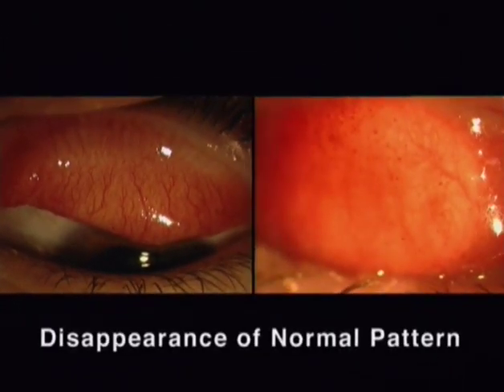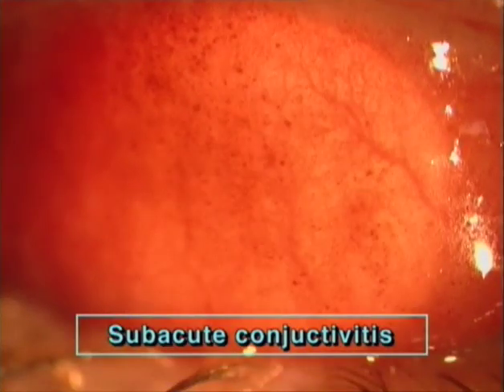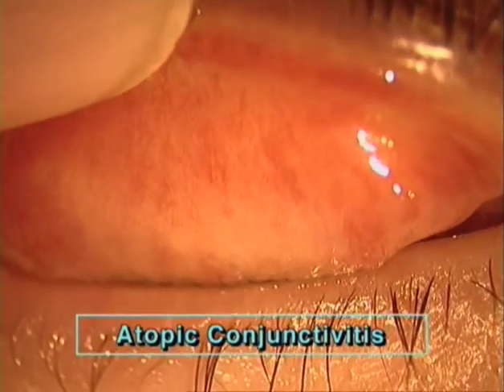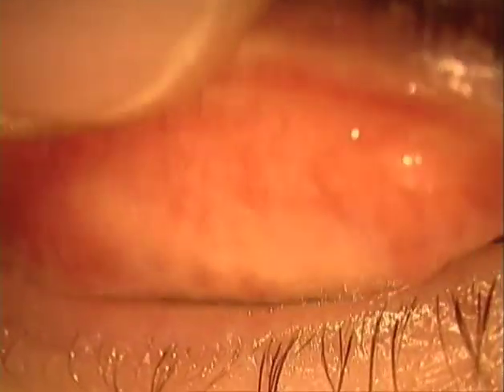In contrast, any invisibility of the parallel major vessels and tarsal glands is a sign of disease, as here in this case of subacute conjunctivitis, where vessels and glands are covered by a layer of inflamed capillaries. Or here in this case of chronic atopic conjunctivitis, where neither the parallel vessels nor the parallel bright glands are visible.